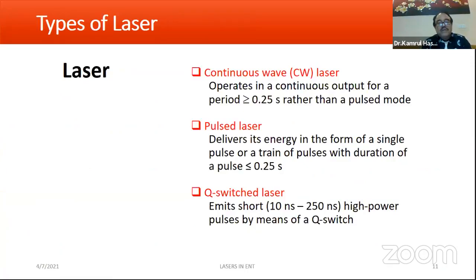How do lasers work? With the laser, one thing is that it comes from a source. You have seen the laser machine. Previously, lasers were delivered with a fiber. Say the diode has a fiber from a source. But carbon dioxide previously had no fiber, and was delivered from a source to the area. It is from the scanner mode.